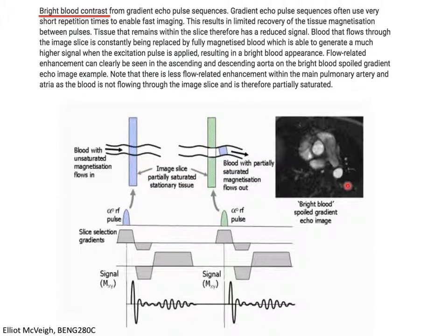In contrast to that, and we haven't done T1 contrast yet, if you pulse in this axial imaging plane, acquiring data with RF pulses and readouts, and the time between those pulses is set to generate a certain amount of longitudinal recovery, such that we get a brightness proportional to T1, then when we apply an RF pulse here, if these spins have not seen any previous pulses, they will give you a very large signal because they haven't been pre-saturated.